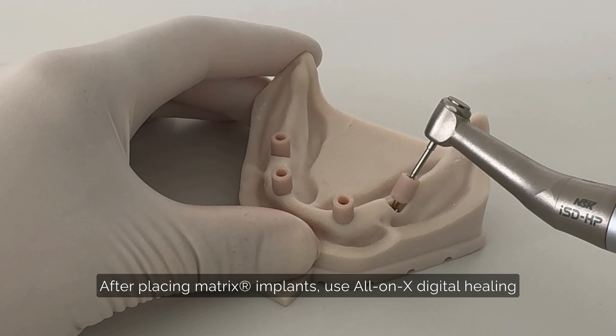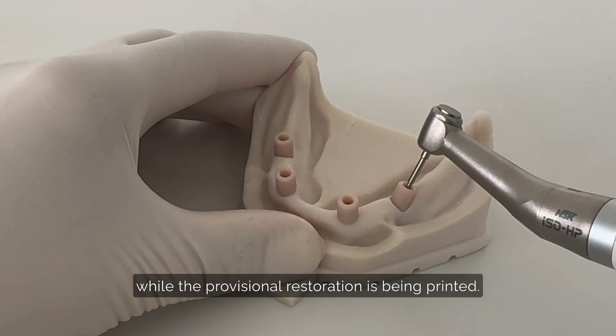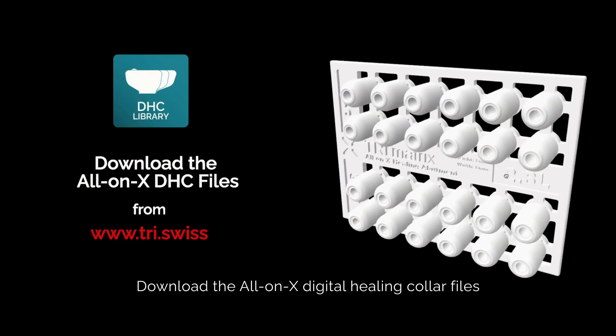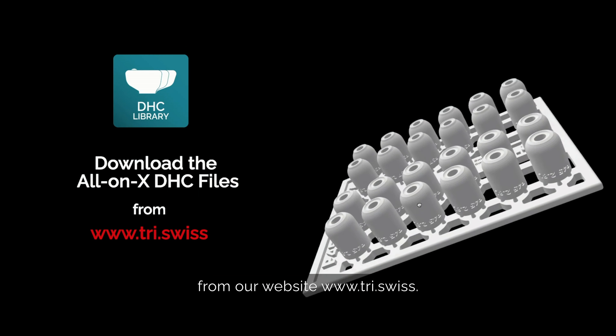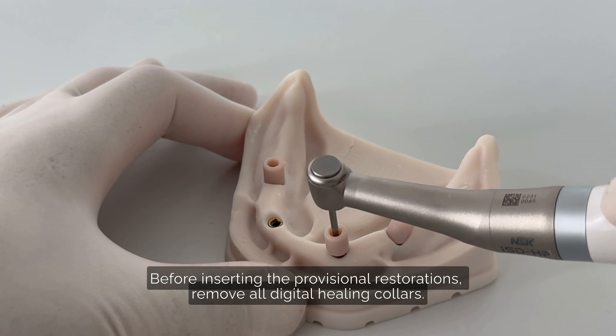After placing matrix implants, use digital healing collars to maintain a clear implant platform while the provisional restoration is being printed. Download the All-on-X digital healing collar files from our website, tri.swiss.